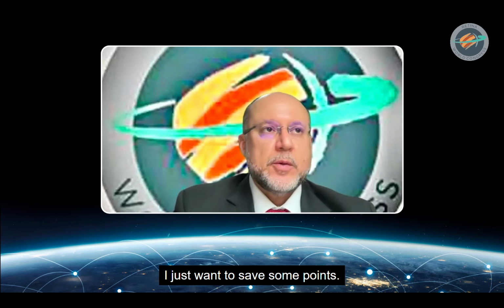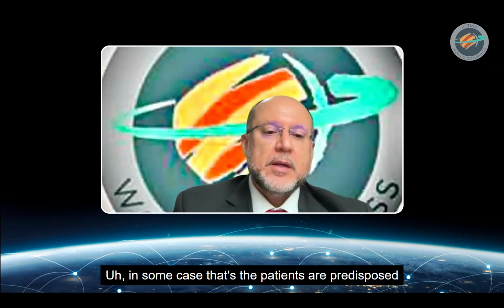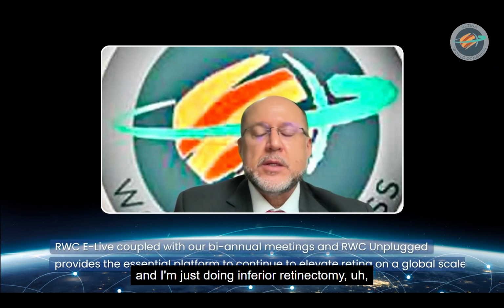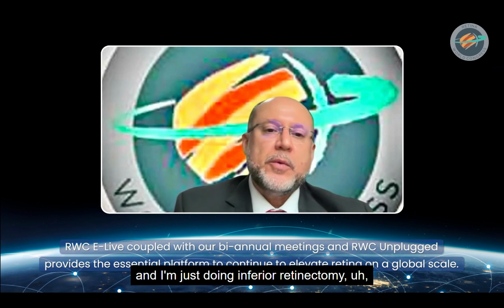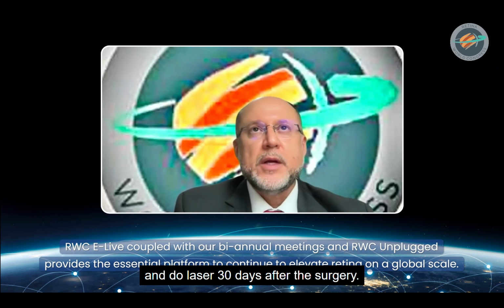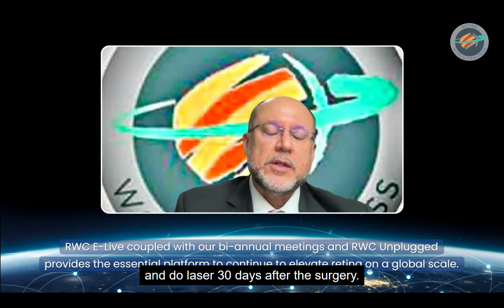Marcelo, great case. I just want to make some points. In some cases where the patient is predisposed to PVR, I'm just doing an inferior retinectomy. I don't do laser. I just go directly for the exchange and leave with oil and do laser 30 days after the surgery.